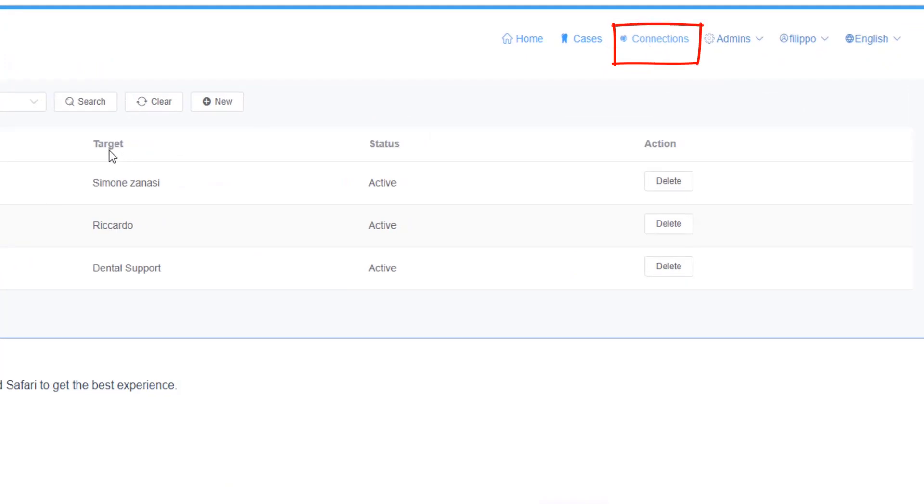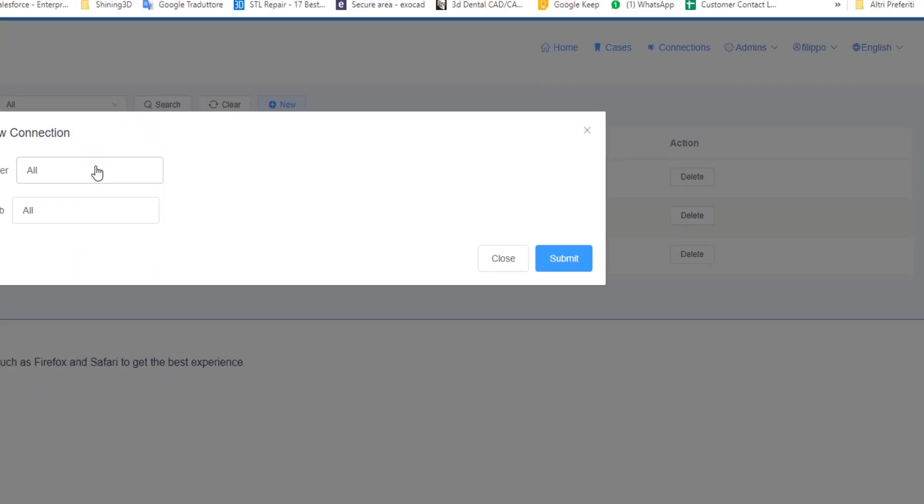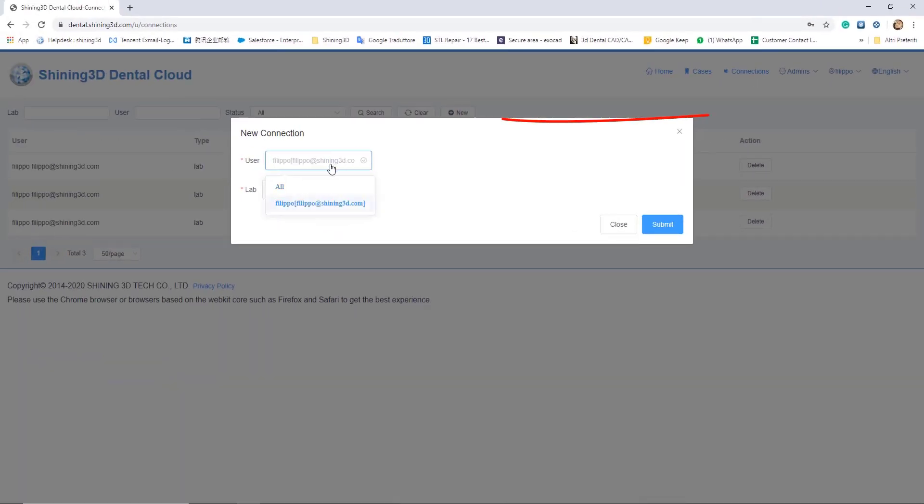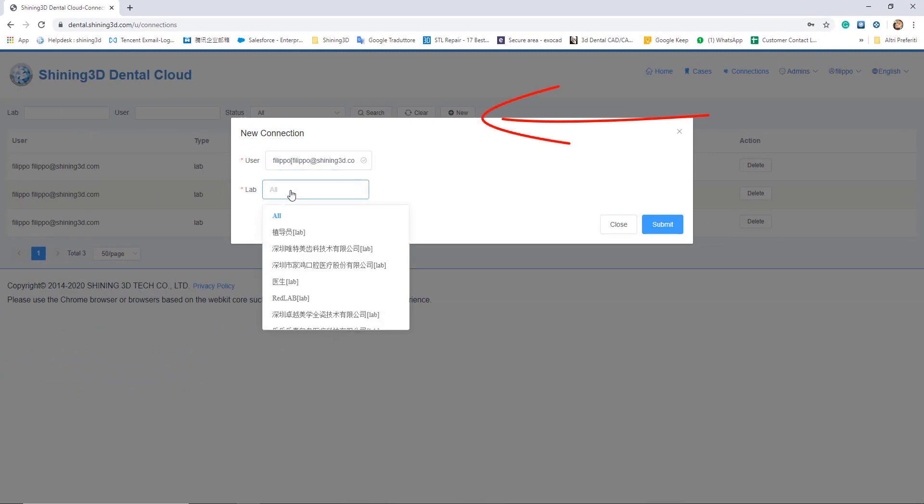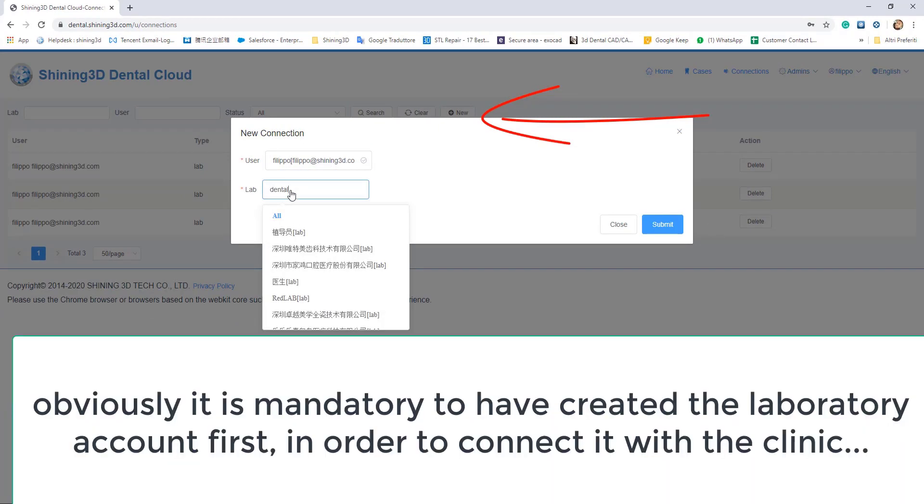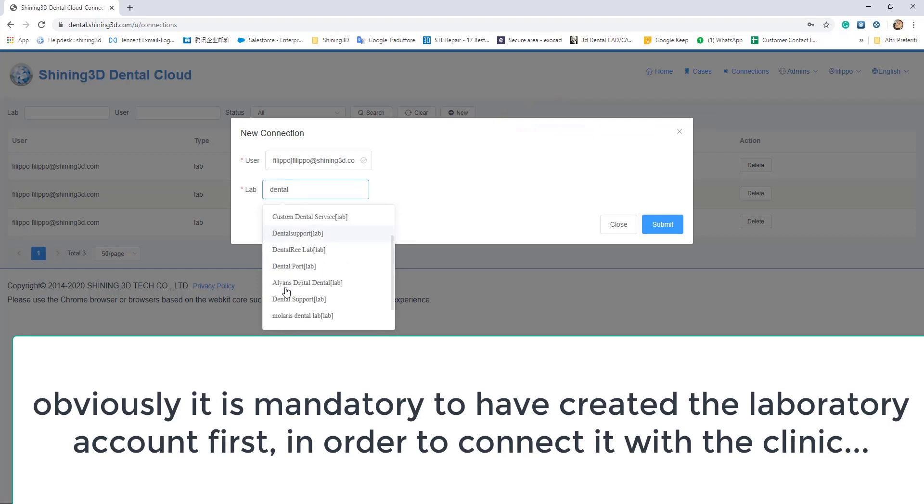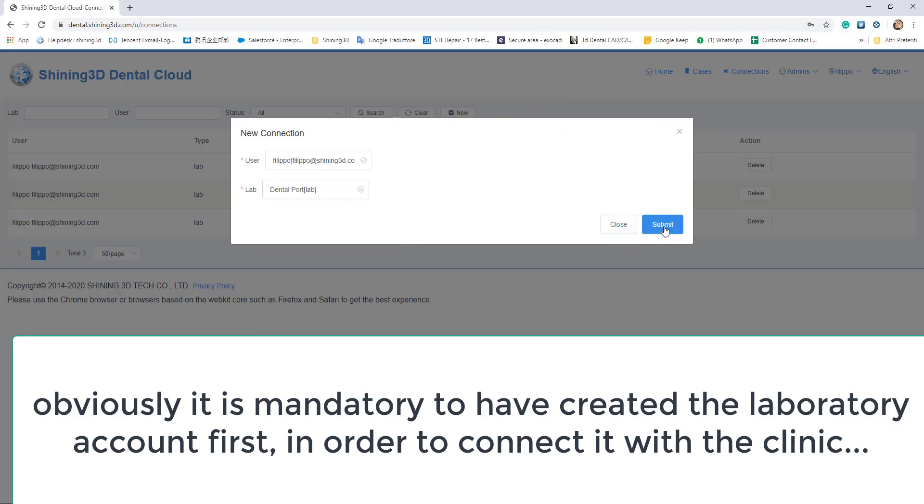Then clicking on connections, then new, it's possible to connect your account with the lab. Obviously, it's mandatory to have created the laboratory account first in order to connect it with the clinic.